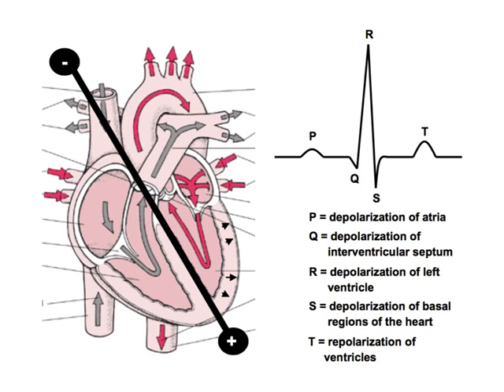Yeah, Leanne. So, did you say the vector goes from the apex to the base or the other way? The vector is along the axis between the apex and the base. We only establish a direction by placing the positive electrode at the apex. If we swap the electrodes, the direction would change too. When we do it, we're generally observing in the direction towards the apex, towards the bottom of the heart, towards the bottom left, from the top to the bottom. So base to apex, negative to positive, top to bottom.